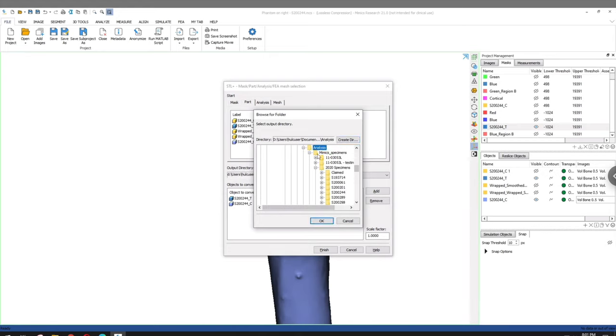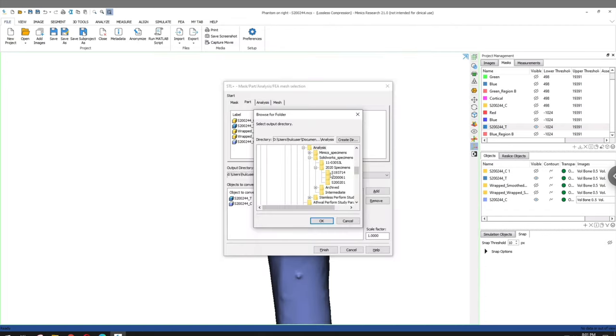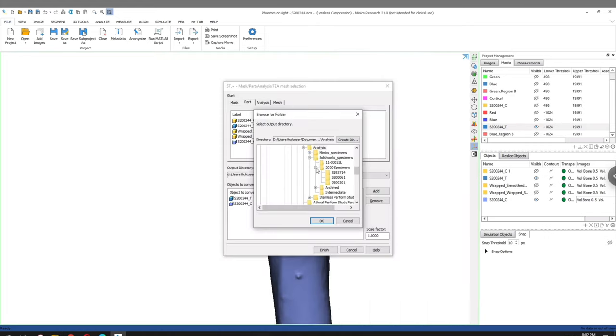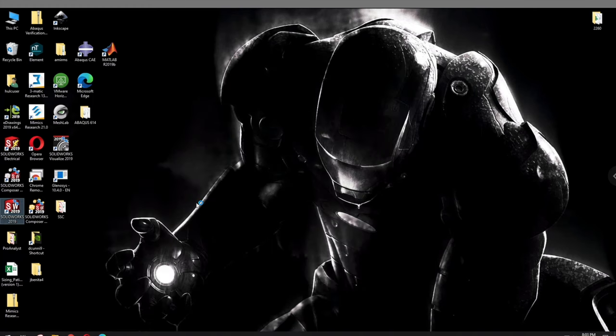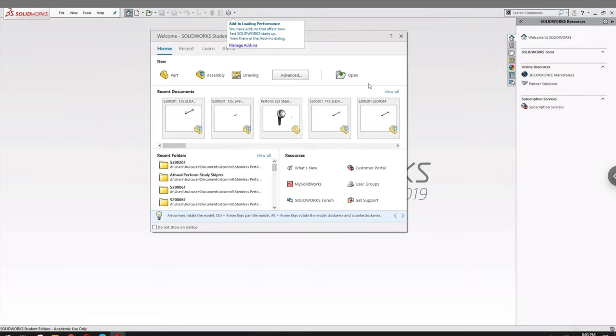Now, it's also important that you're using an ASCII STL as opposed to a binary STL. And this is just important as, at least as far as my experience goes, it's interpreted by SOLIDWORKS quite a bit easier. Now, as a personal preference, I like to ensure that all of my file naming conventions are properly followed, and of course that the specimens are saved into the correct place. So my suggestion would be to, of course, do this internally within Mimics as opposed to renaming them using the auto-generated convention names.